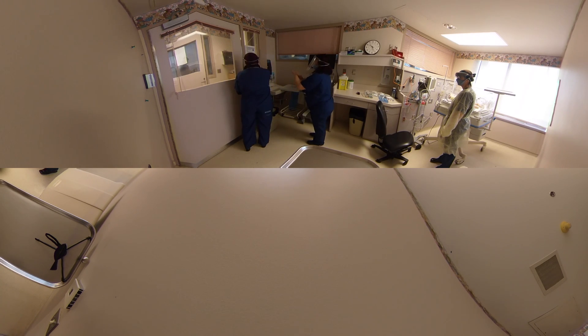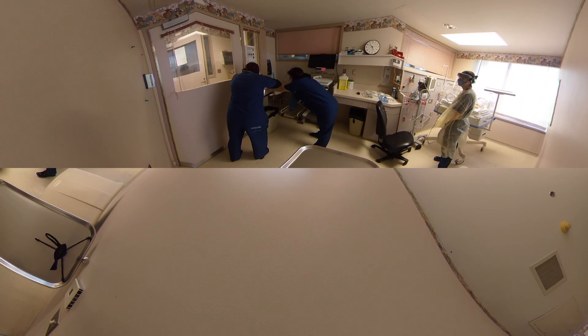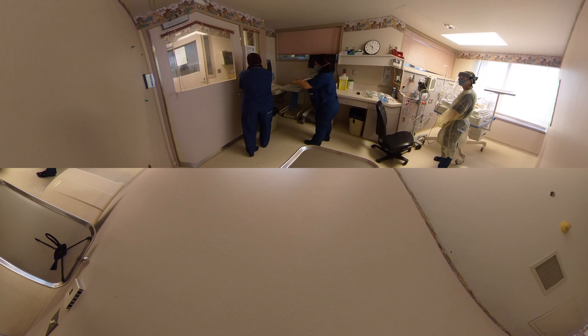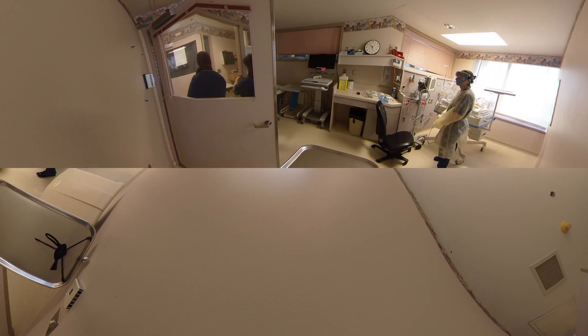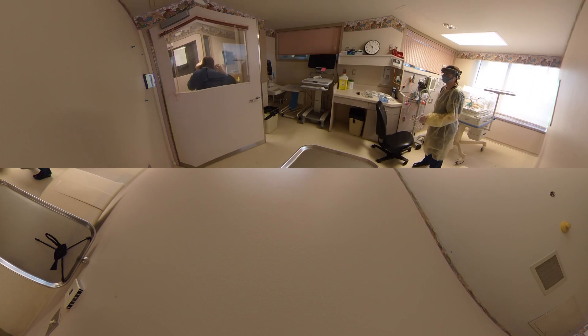Fifteen seconds of hand rub with alcohol-based hand rub. Then we have to remove our visor — drop it off. Again, fifteen seconds of hand rub. Then we're going to step out of the room and take off our mask. Take the bottom part out, without touching anything, pop it off and drop it off.